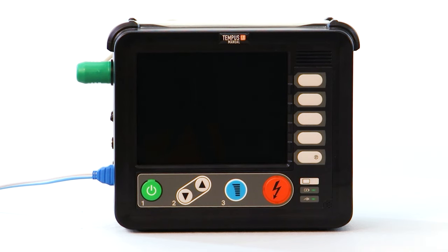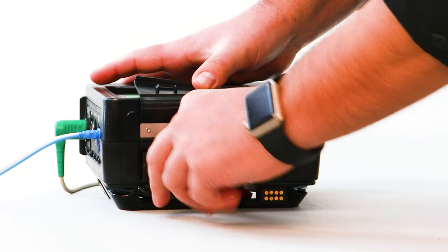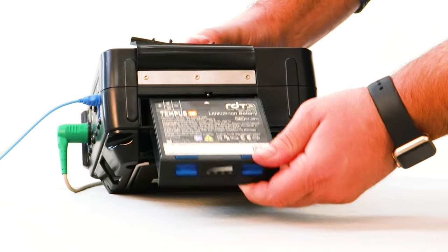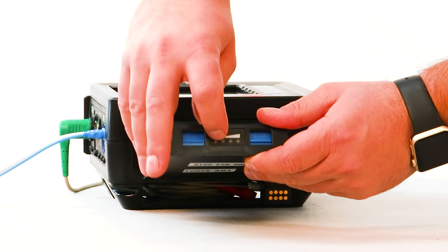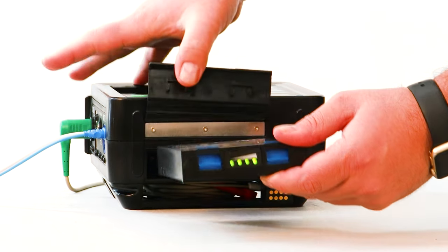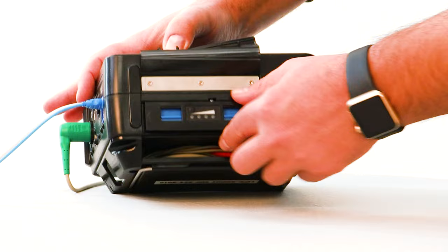Designed to be ready when needed, the battery status LED light on the front right-hand corner of the device will blink green, indicating it is ready for use and has passed its daily self-test. The lithium-ion battery is located on the bottom of the device under the battery cover and provides up to 300 shocks at adult level energy or more than 12 hours of monitoring on a full charge.